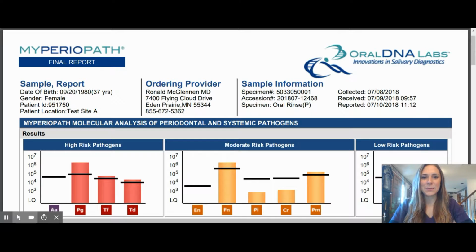I'm here to explain the rest of the process to you. Once the test is collected and the saliva sample is packaged into the box again, the clinician will put the test into the FedEx bag that is provided with the test, and a shipping label is printed off of the Oral DNA website. This can only be completed if the clinician has an account with Oral DNA.